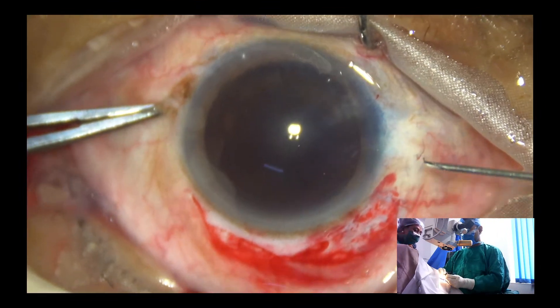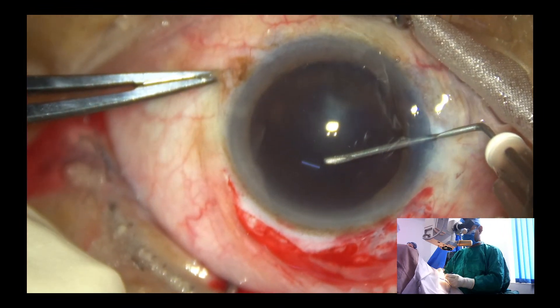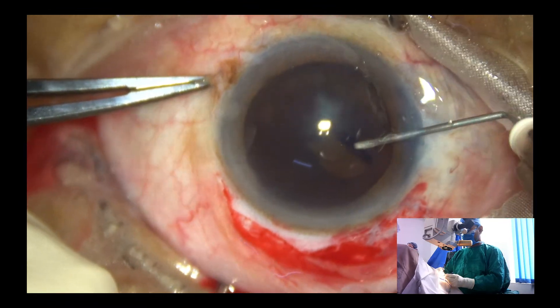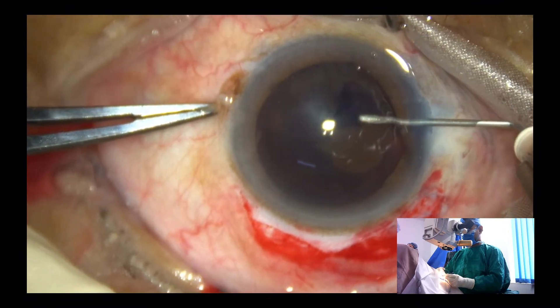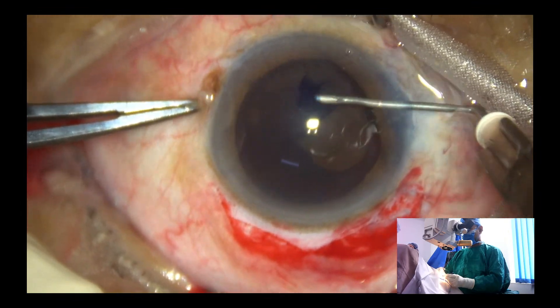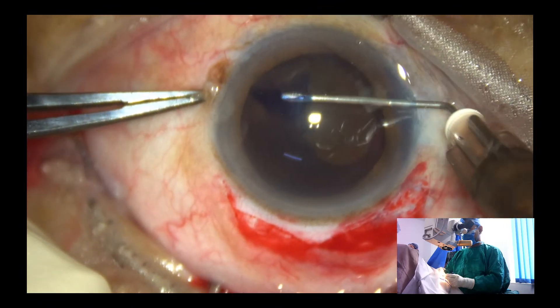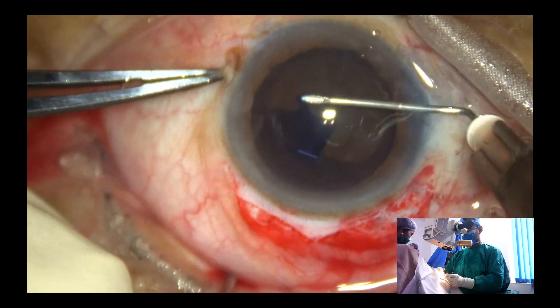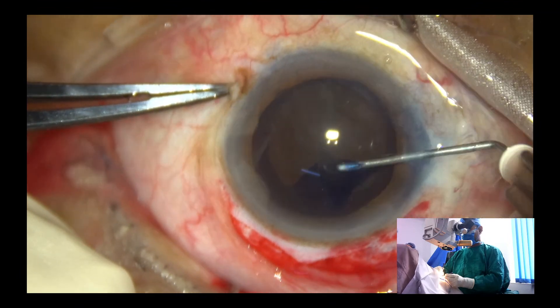This is a cystitome — just bend a 26-gauge needle and make this cystitome. We have to do a large rhexis. I'm looking at the eye under the microscope.